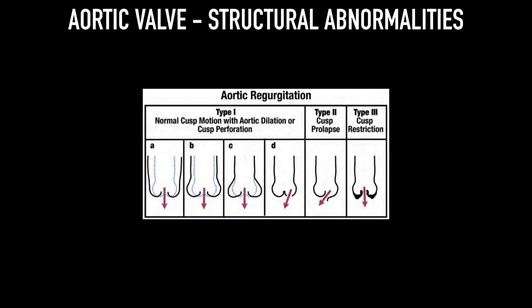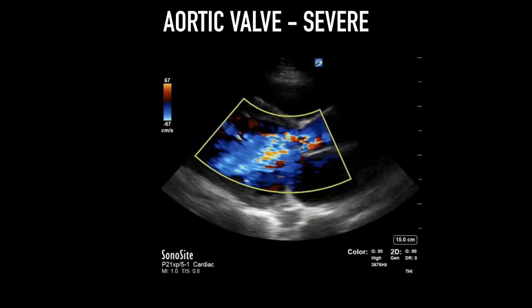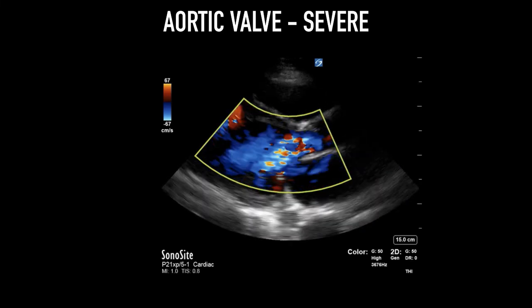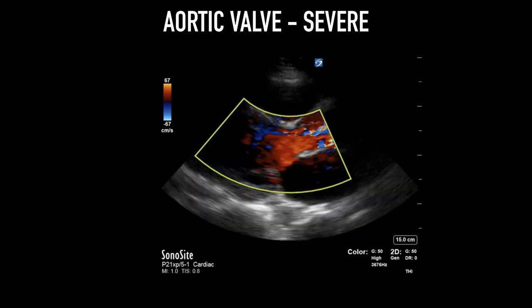In the case of the aortic valve, the equivalent of LV abnormalities is aortic root abnormalities. Any dilatation of the aortic root will lead to central aortic regurgitation. Other abnormalities include cusp perforation, prolapse, or impaired motion, usually leading to eccentric jets. This clip shows severe AR — you notice that the jet width relative to the LVOT is very high, suggesting significant aortic regurgitation.